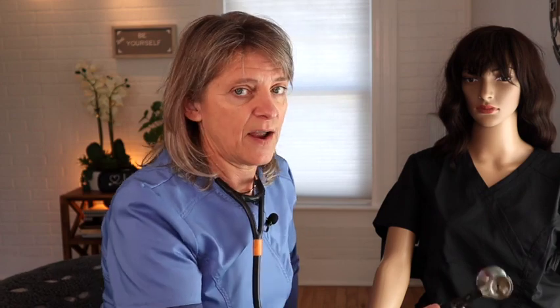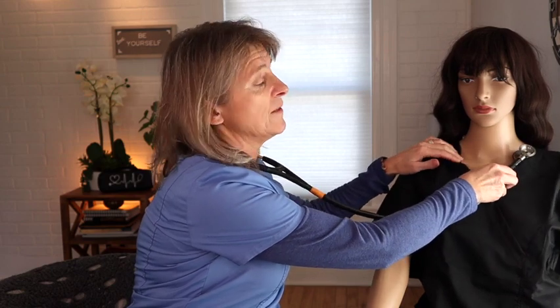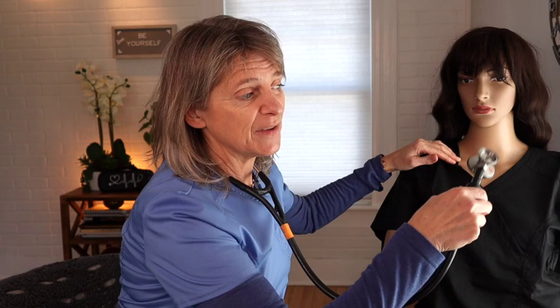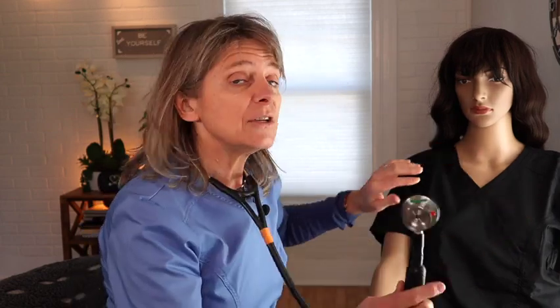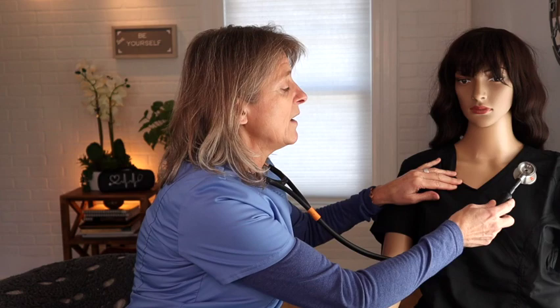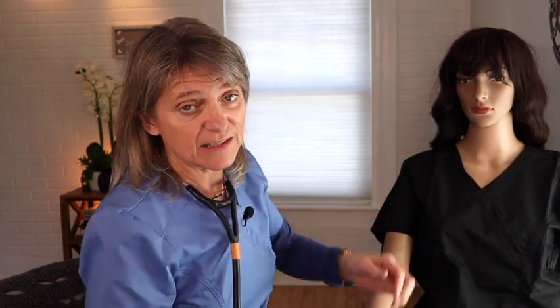I'm going to listen to your lung sounds. Every time you feel the stethoscope go on, go ahead and inhale and exhale out through your mouth. We're going to do one cycle of breath — inspiration and expiration. We'll start on the anterior part of the chest, the front, starting right above the clavicle. Always compare each side for symmetry — check one side then the other. I usually do about six to eight points on the front of the chest, going underneath the clavicles through the second intercostal space down to the next spot, always including the lateral sides of the chest.